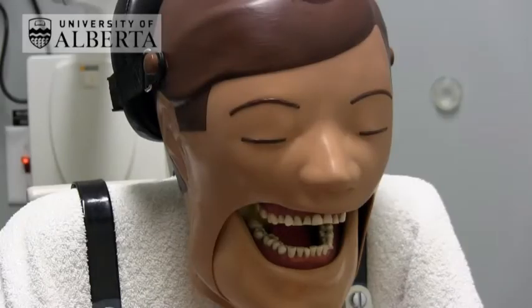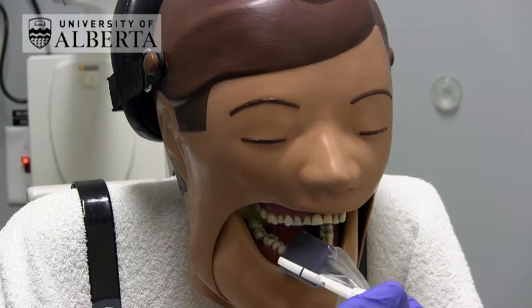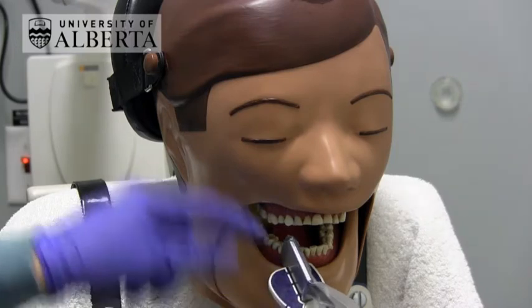For upper posterior periapicals using a sensor, angle the bite block and place the sensor behind the maxillary teeth of interest. Always make sure that the patient is biting on the widest portion of the bite block.